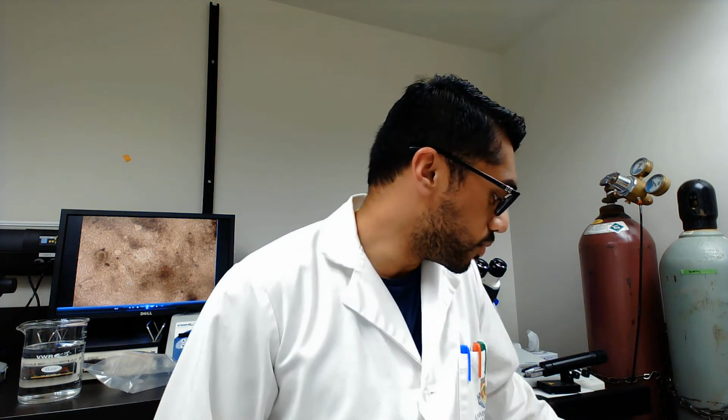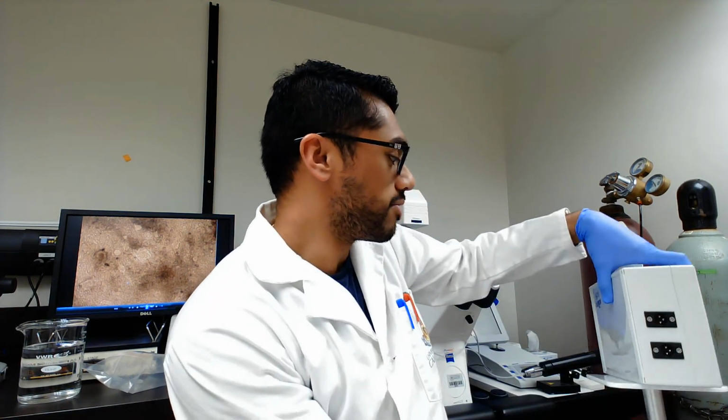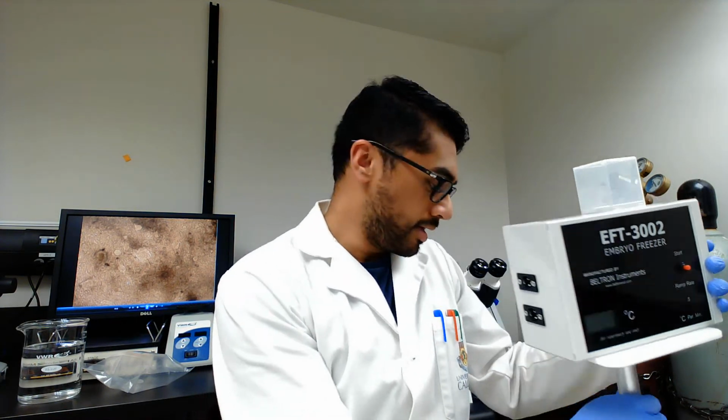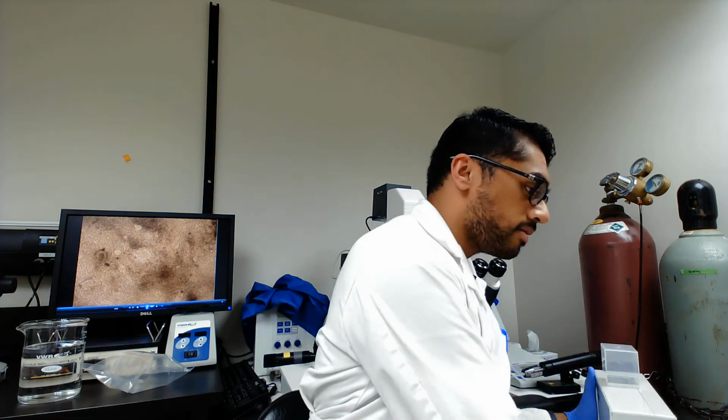Alternatively, if you don't want to turn your blastocyst into an embryonic stem cell line, we can freeze or cryopreserve them in something like this. This is our embryo freezer, and we can freeze them, and at whatever later date we want, we can then implant that blastocyst into the uterus of an animal, and hopefully a new life is born.